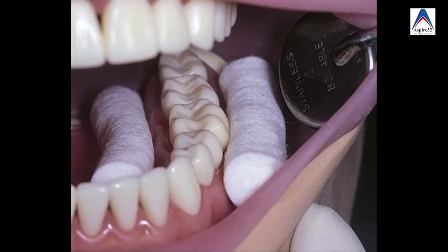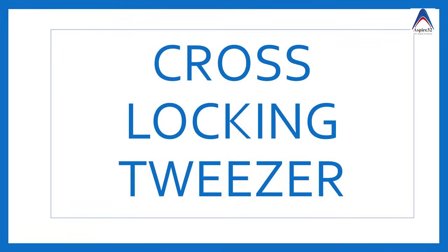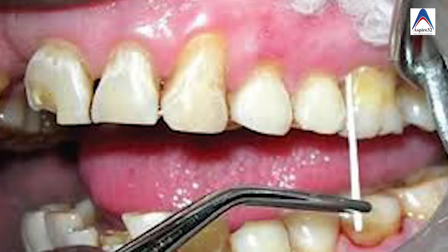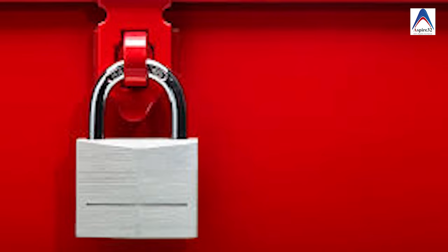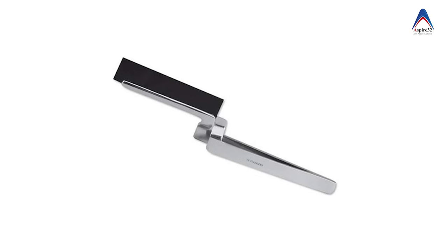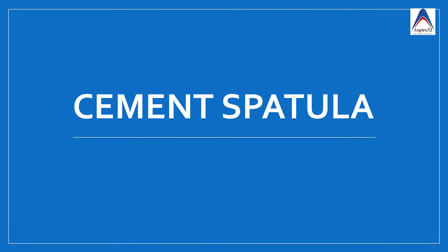We also have tweezers. These can be used for placement of cotton rolls, or you can have locking tweezers or cross-locking tweezers, which are useful when carrying instruments like endodontic files to prevent aspiration since the material gets locked. There are also articulating paper tweezers, used when checking the bite.